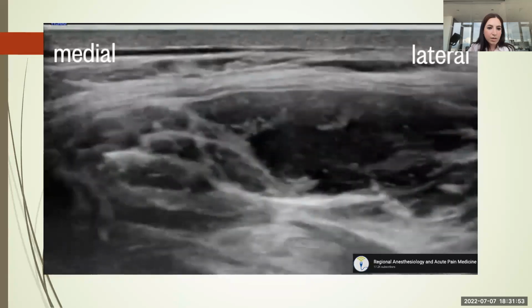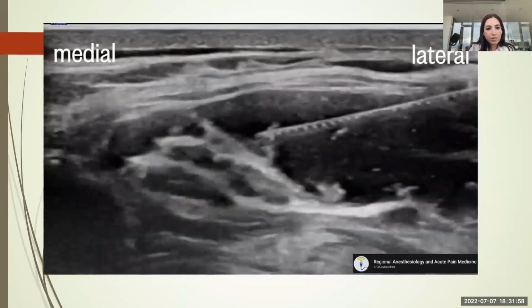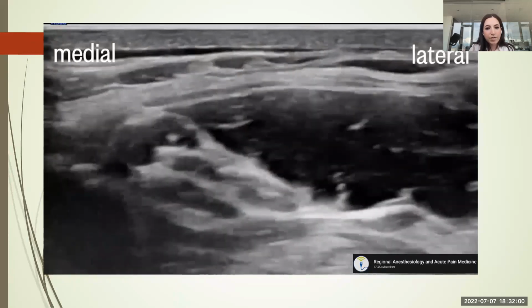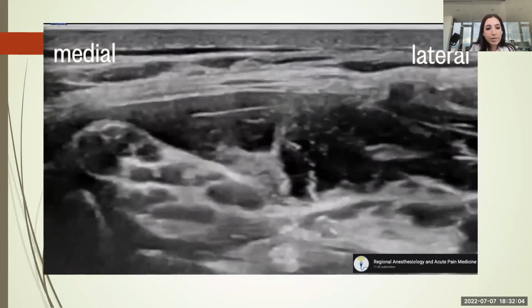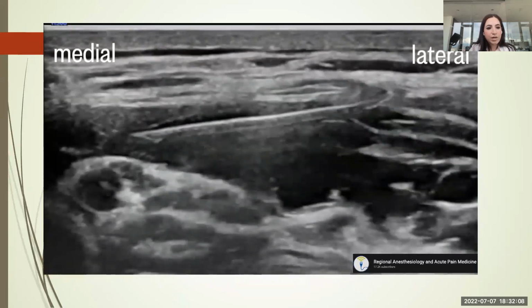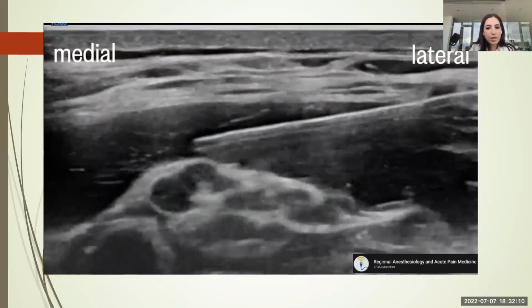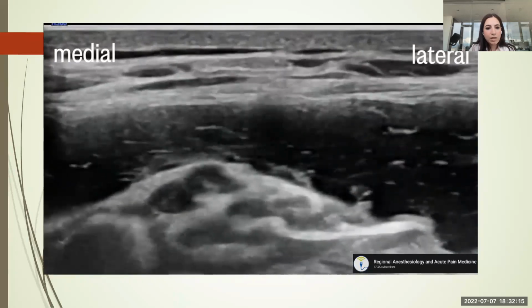This approach does reduce the risk of nerve injury theoretically, and it will provide analgesic benefit, and possibly, given adequate soak time, will have good block density as well, but they may not achieve surgical anesthesia to the same degree because of those septations that we talked about.